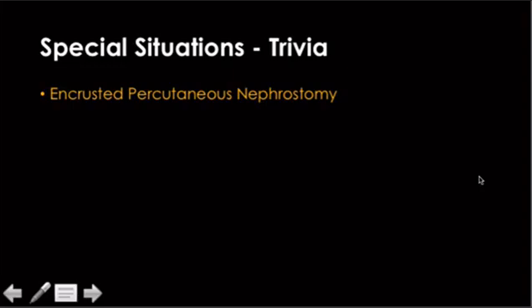Just remember, this is another thing just to know, if you can't get the pigtail to release, and you can't pull the thing out with the pigtail still in place, you'll lacerate the kidney. So the pigtail has to be released. Or what if you can't get it to release?